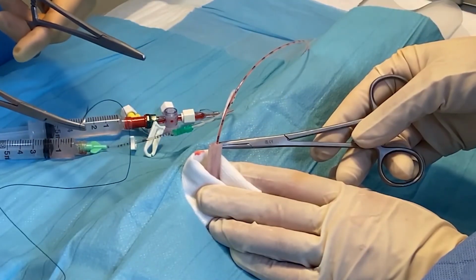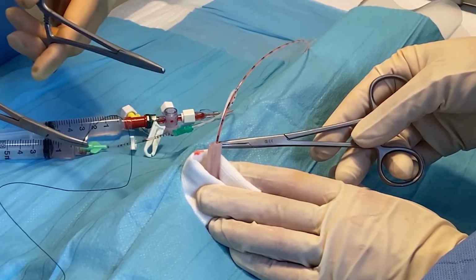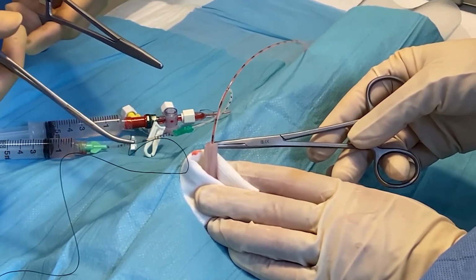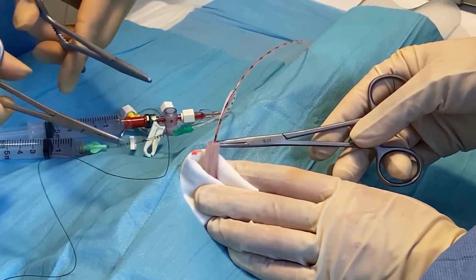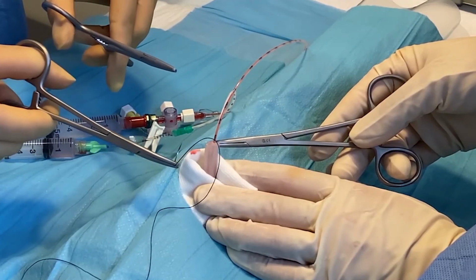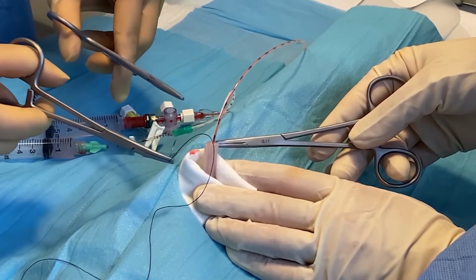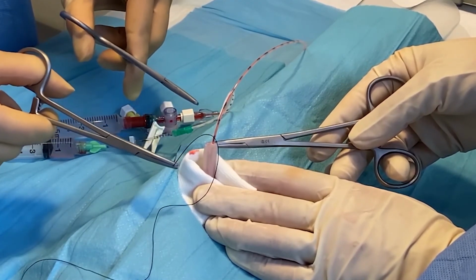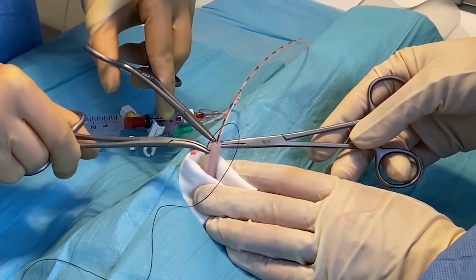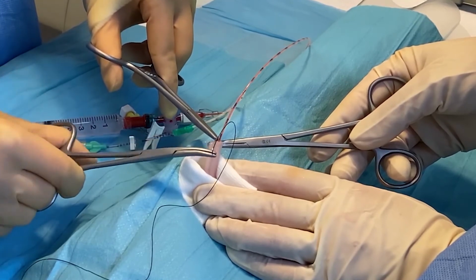When it comes to suturing the catheters in place, you want to be holding your needle with one pair of forceps, and then you need another pair of forceps to then grab the needle as you've pushed it through the cord. It's extremely important to not pierce the catheter itself. Take a good chunk of cord.